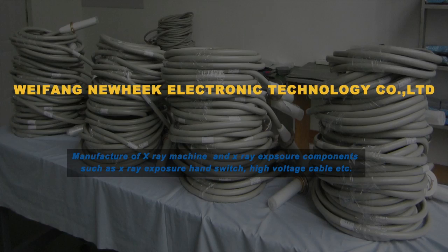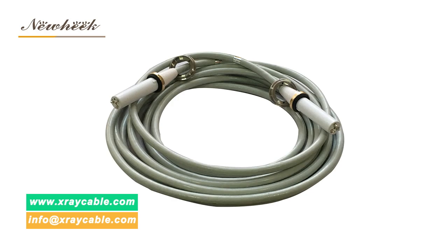Nuheek's U-Arm standard configuration includes an X-ray high voltage generator, X-ray tube, collimator, U-Arm, digital flat panel detector, image workstation, and two high voltage cables.